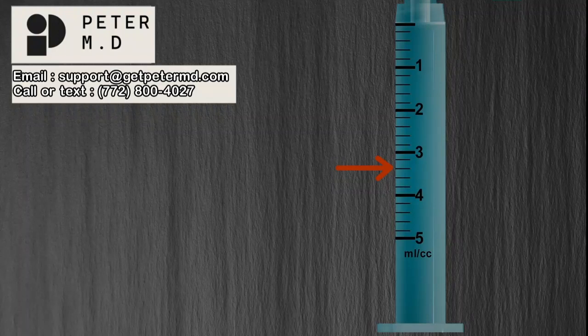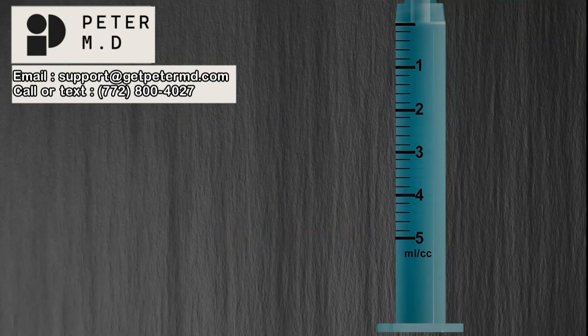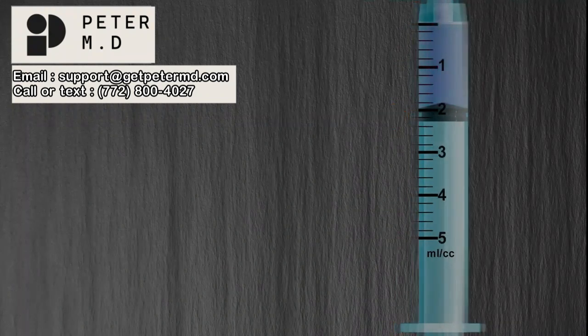So how much does this line represent? If you stated 3.4 milliliters, you are correct. How about this line? If you stated 4.8, you are correct. Now let's get a little more realistic. Instead of using an arrow, let's use the top ring of the stopper as our indicator and fill the syringe with medication.